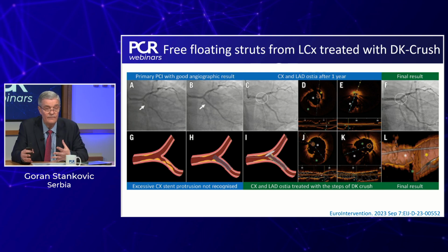And there are two different options that I wanted to share with our colleagues. So if you have floating struts, whether it's floating from the ostium of the LAD or from the ostium of the circ, there are two different approaches.